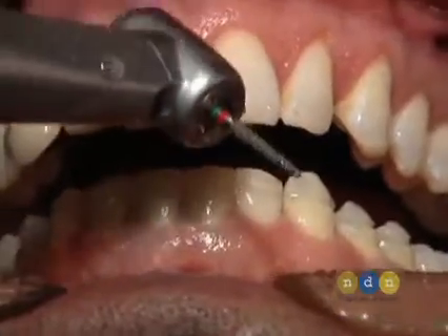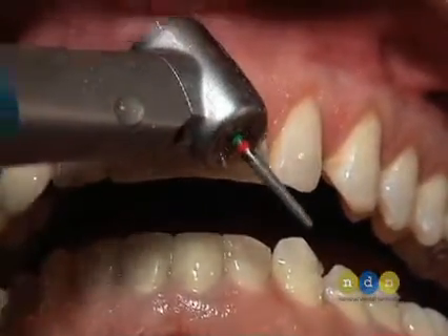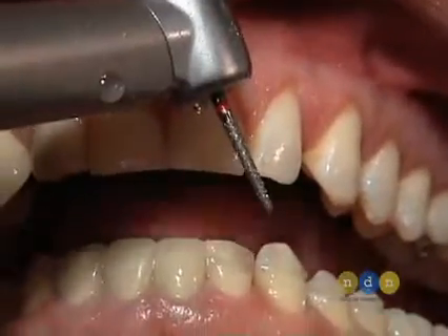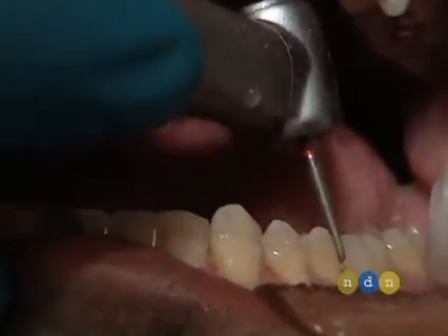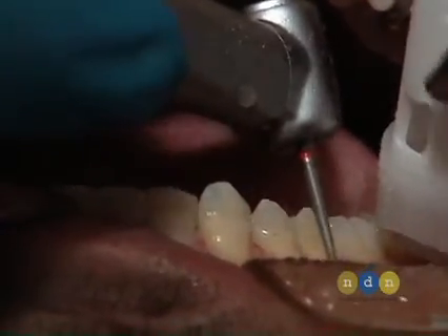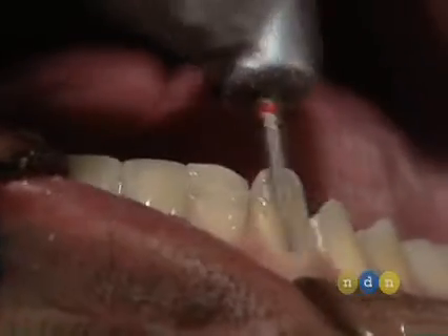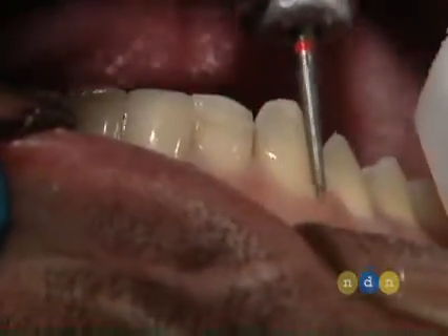Now we're going to take the chamfer-ended diamond, the LVS3, which has a safe cutting end to it. You can see it has a little bit less grit on the end, down by the tissue — Dr. Goldstein developed this one also. We're going to join those depth cuts, forming a chamfer right at the tissue level. No need to retract the tissue here. It's kind of a sweeping brush motion on this burr rather than a heavy cutting motion, taking just a little bit of enamel at a time to make sure that we have room for half a millimeter of porcelain.